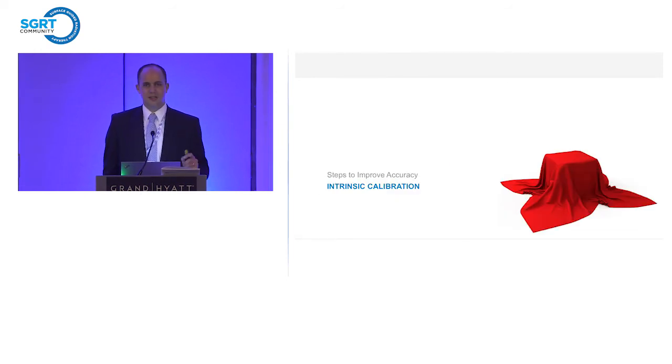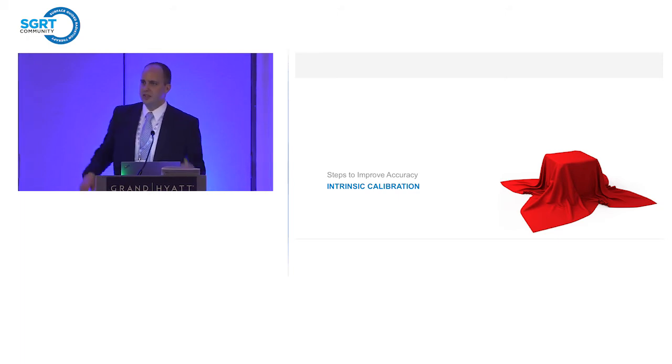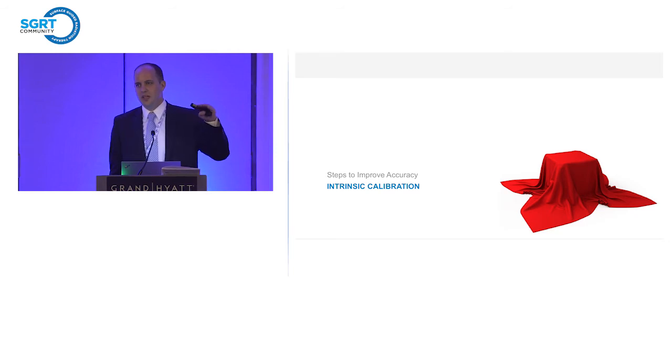All right, this is the new bit. So everyone scoot to the edge of their seats a little bit. This is with respect to the intrinsic calibration. So this is defining the optics of the camera. I mentioned right now we do the raised plate calibration, and we basically capture the focal length and the different parameters from each sensor at that one location.